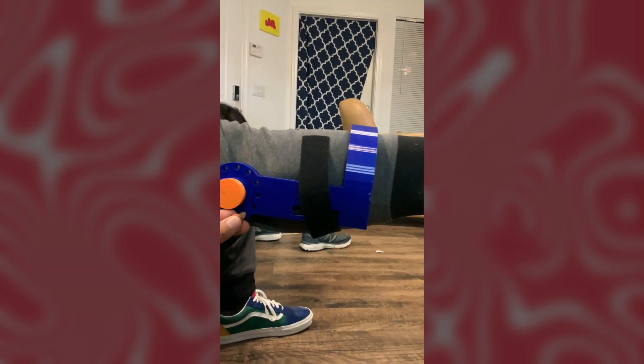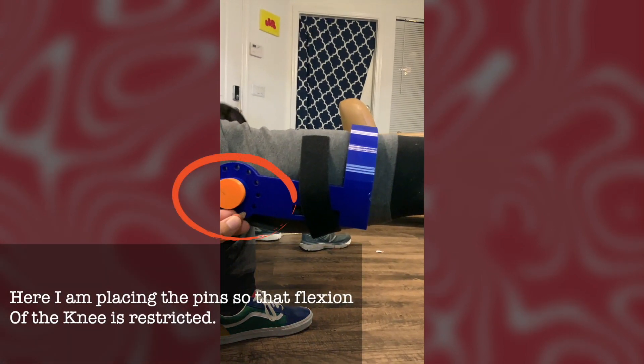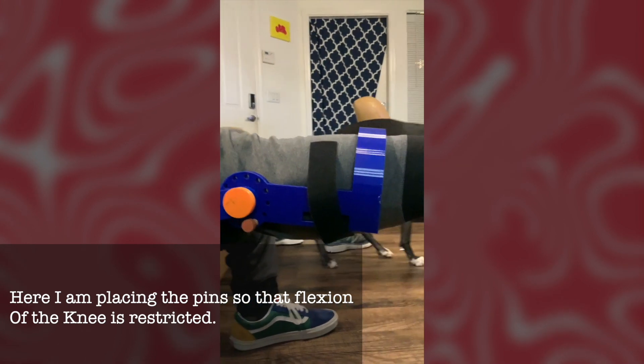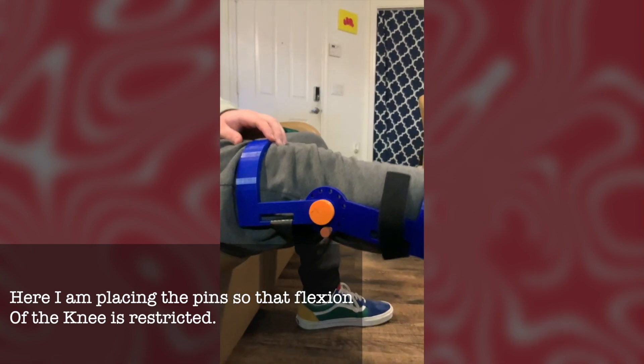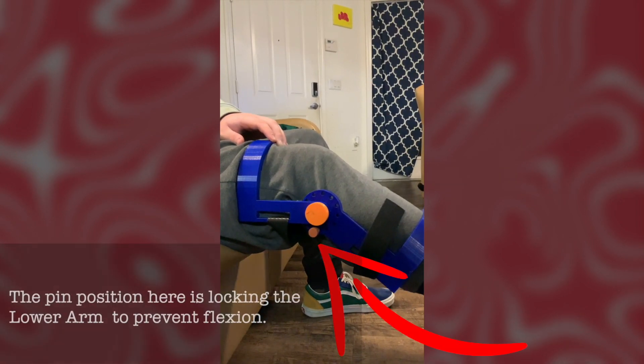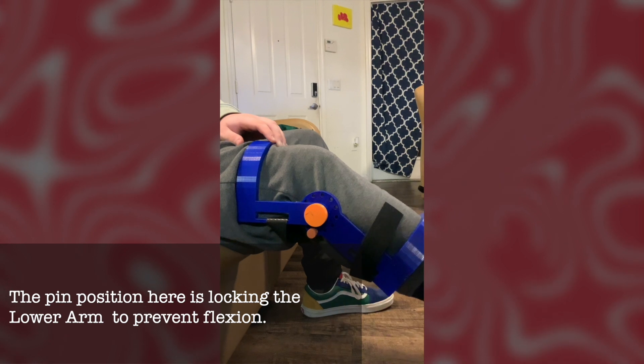In this setup, I've set up the pin in such a way that the flexion of the knee is restricted. The pin is blocking the lower half of the brace from going into extension or flexion from the flexion position.